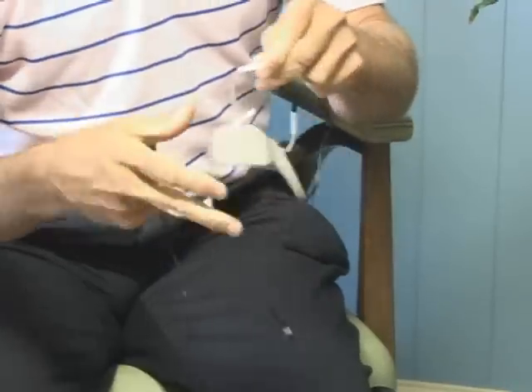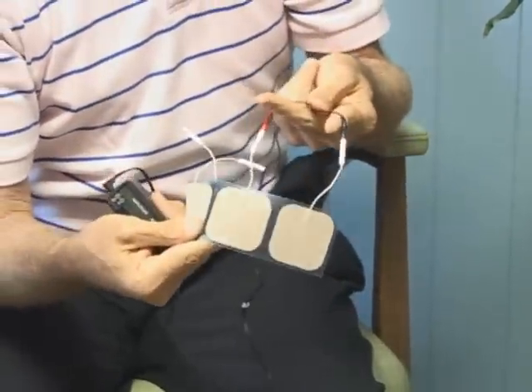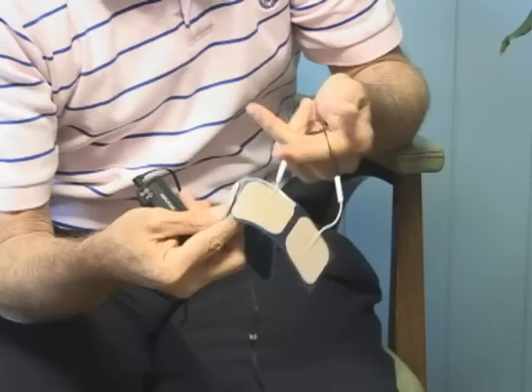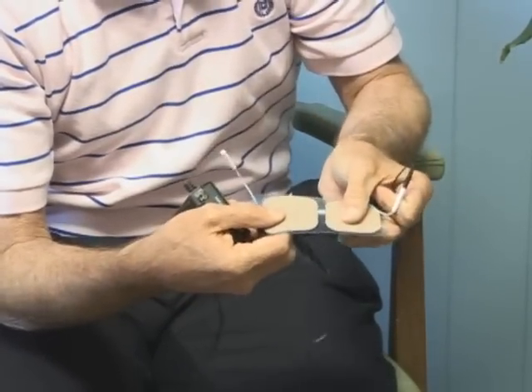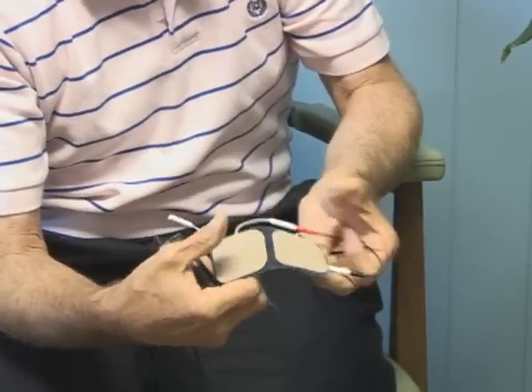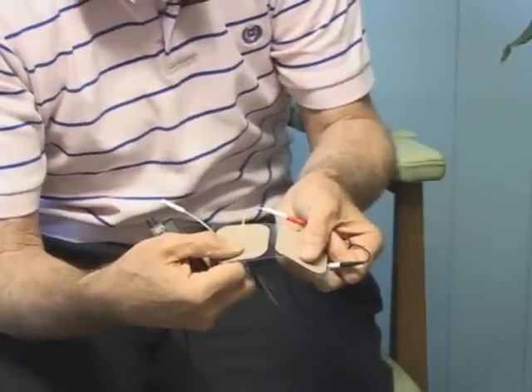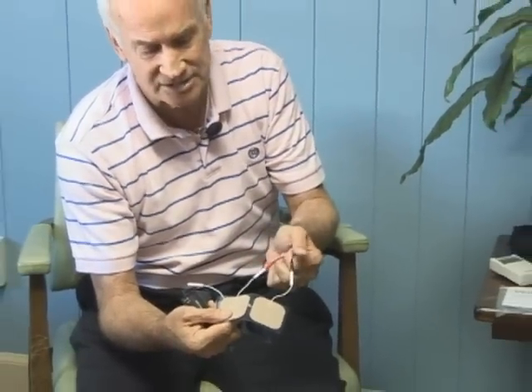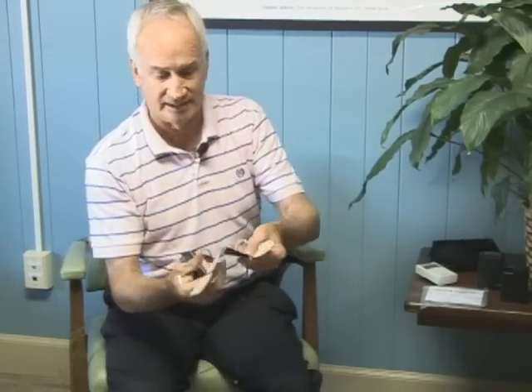Let me explain this because it gets confusing for people, justifiably so. They see these cables that have black and red. The reason for black and red is really nothing significant. When electricity comes out of one electrode, it's got to go somewhere — it goes to the other electrode. The area between the two electrodes is where the electricity travels. It doesn't necessarily go from black to red or red to black. This color coding started back in the 1970s and has continued to this day, and many times it causes confusion. Don't let it confuse you.